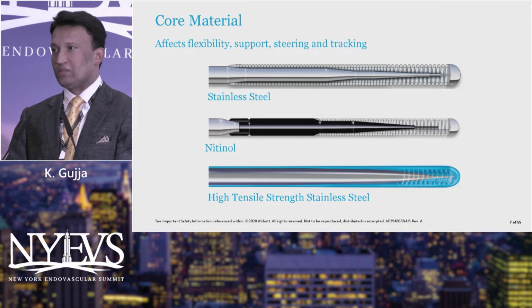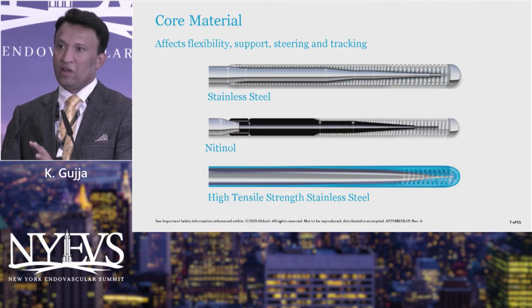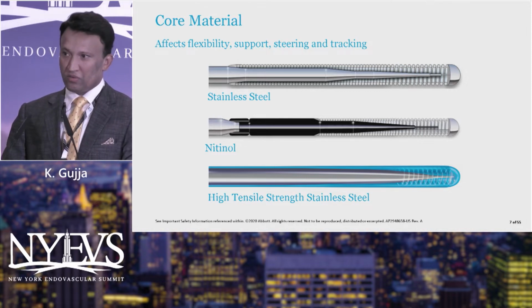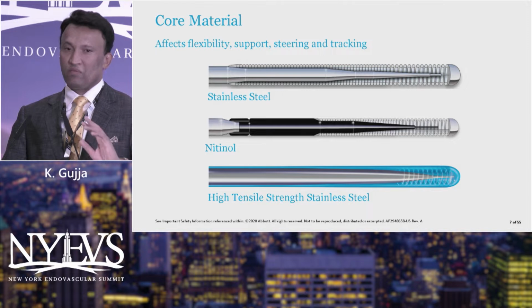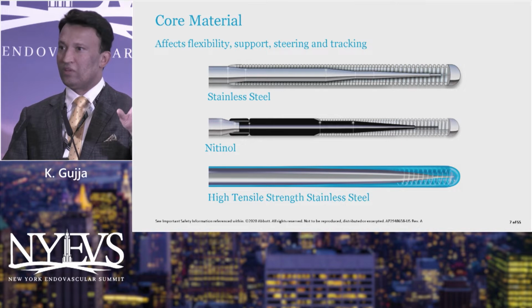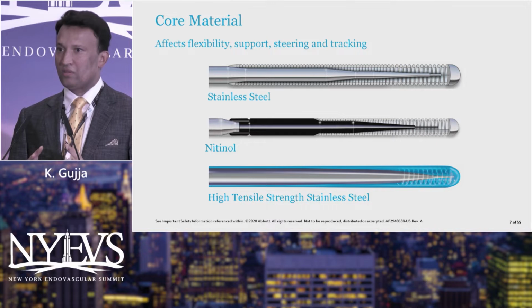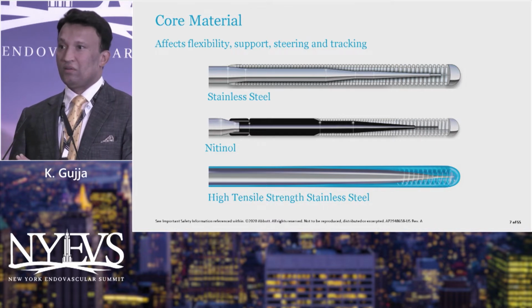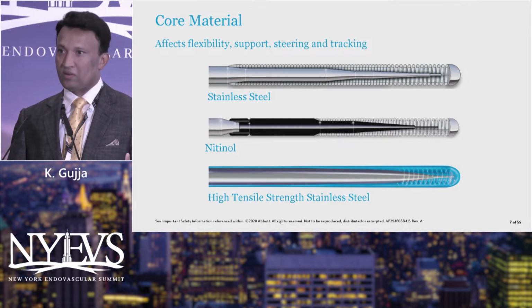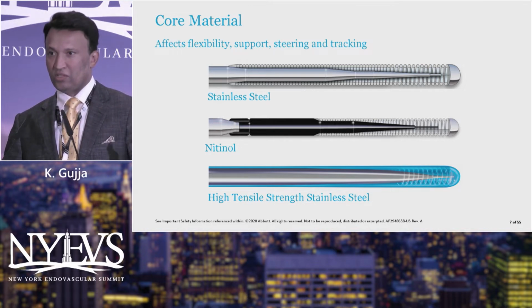Remember, if you are doing tibial vessels, the more you push, all that pushing, all that torque will happen in the iliacs and in the SFAs. So your sheath is coming back. If you parked your support catheter in the SFA, that's coming back. So everything is going up into the aorta. By the time you even realize, you're already way up to the level of the renals, and now you have to take everything out and back in, and put in a 035 wire. You just added 20 more minutes to your case just because you didn't choose the right wire. That's where the problem comes. It's not like other vessels like hepatics, renals, or carotids. These are different because it increases the length of time for the case and increases radiation time.